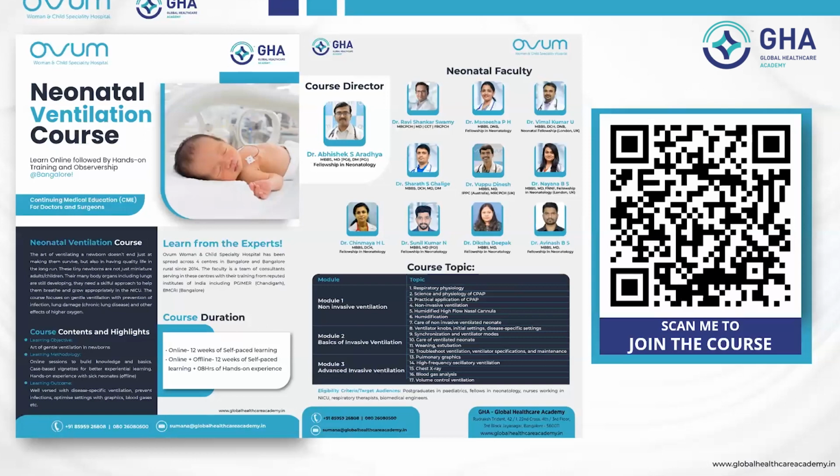Abhishek, you're muted. So what's the minimum and maximum PEEP range we can give? I think all these are variable with respect to the baby. But if a baby has respiratory distress, I think 5 is the minimum. If the baby doesn't have respiratory distress or the baby has improved, 4 is the minimum. Less than 4, I don't think we will be giving CPAP for these babies.